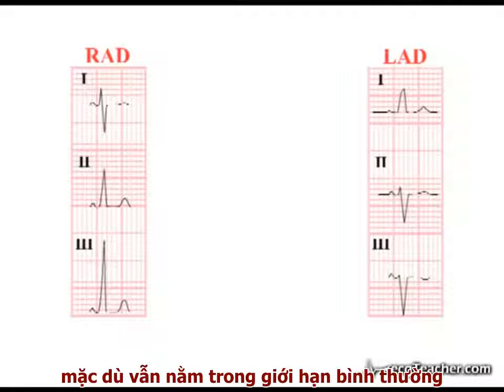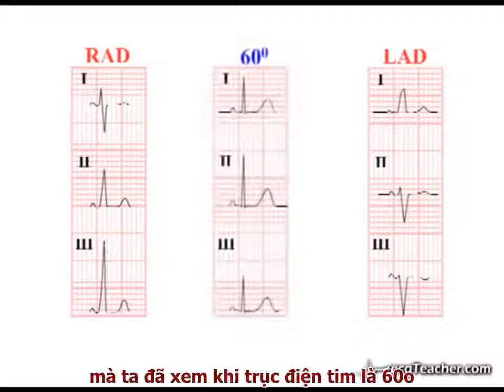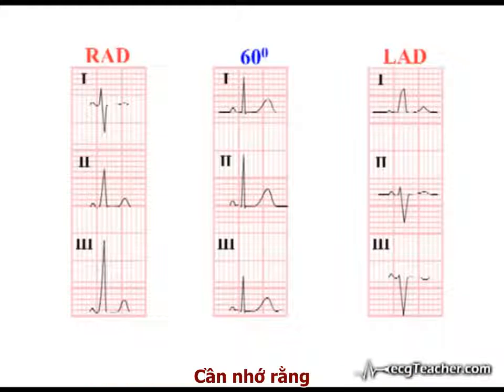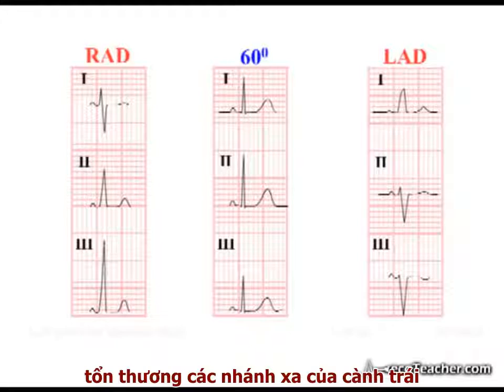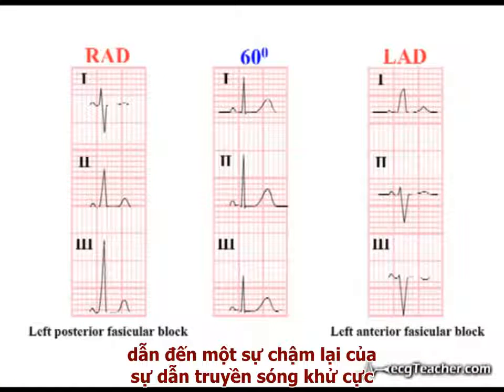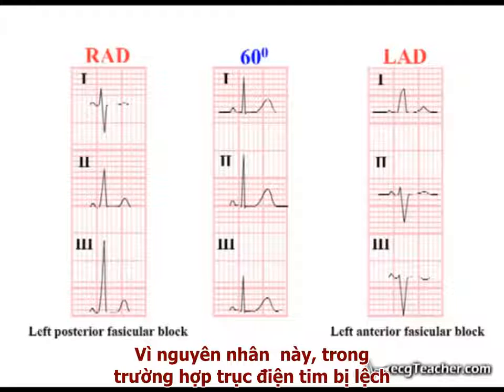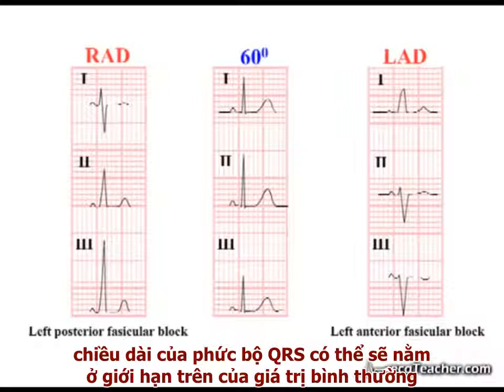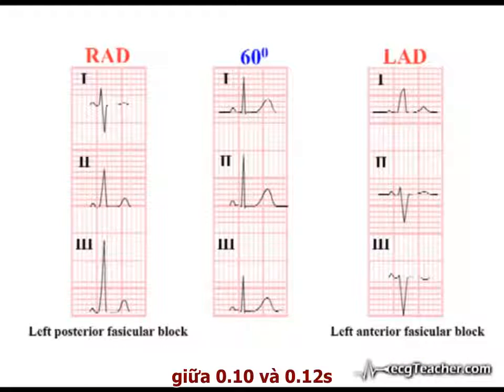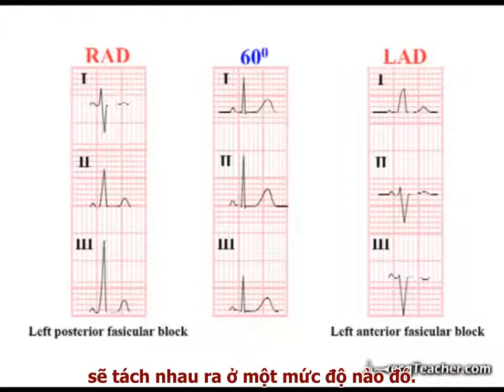You may have noticed that, although still within the normal range, the QRS complexes in both LAD and RAD are somewhat widened compared to our starting readouts with the axis at 60 degrees. Keep in mind that damage to the distal branches of the left bundle branch, the commonest cause of axis deviation, results in a slight delay in depolarization of the affected region of myocardium. For this reason, in axis deviation, the QRS duration tends to be in the upper limit of the normal range, between 0.1 and 0.12 seconds.